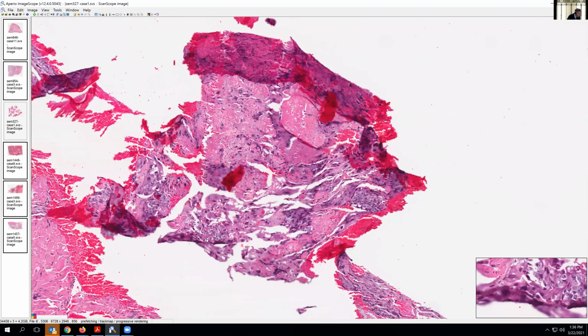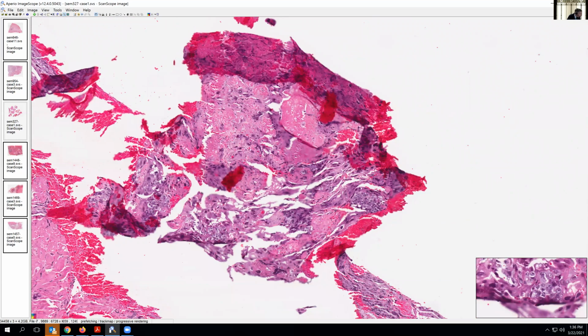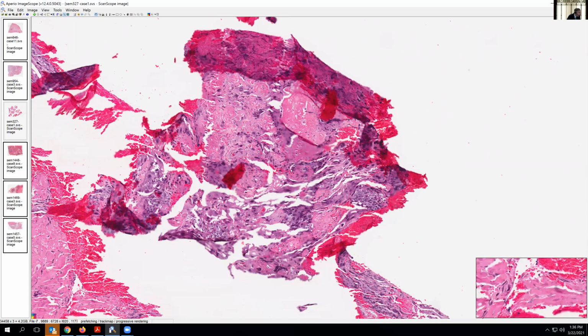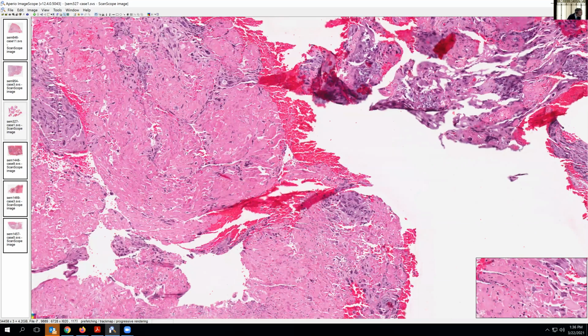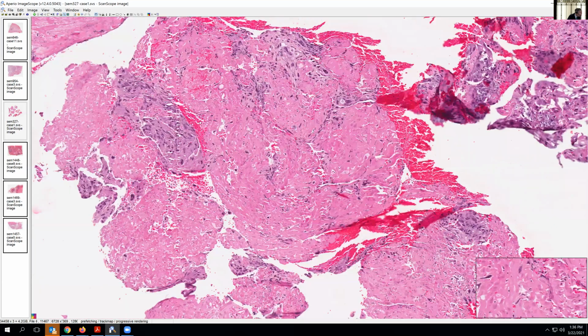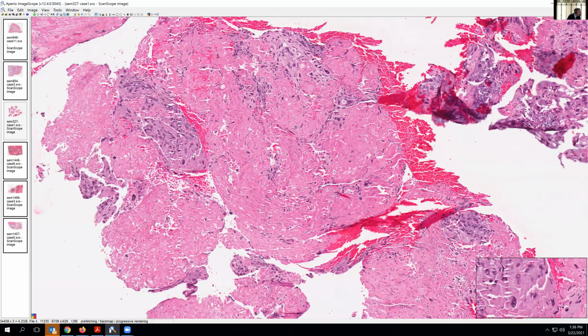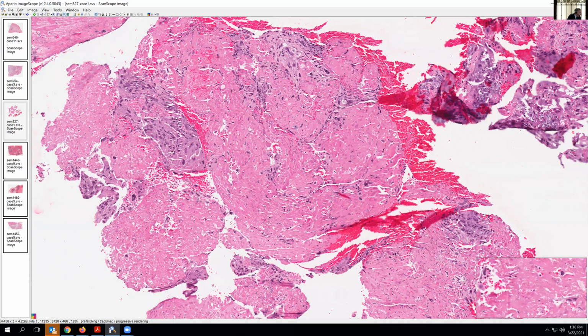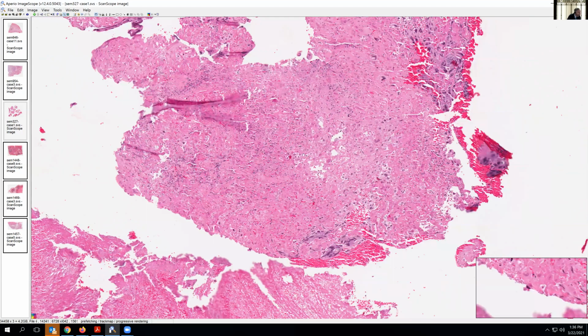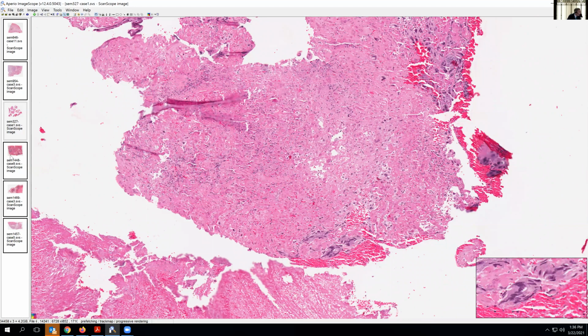Here again, we can see these cytotrophoblastic cells, intermediate trophoblast, admixed with this backdrop of very fibrinoid necrotic tissue. And here you see a little bit of myometrium with the trophoblastic infiltration, some single cell pattern, and here we see it again. So this gives us a little idea of what this looks like in a curettage sample. Fragments, maybe with some admixed myometrium and necrotic tissue, and little islands of highly atypical cells.